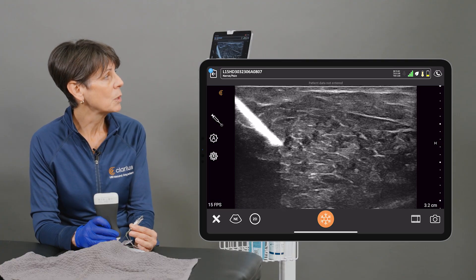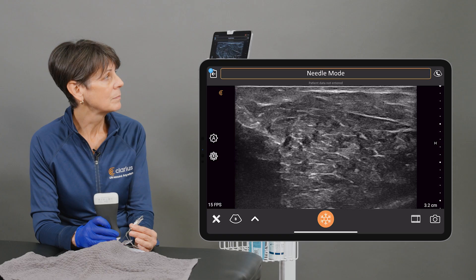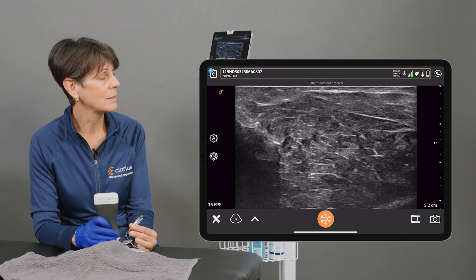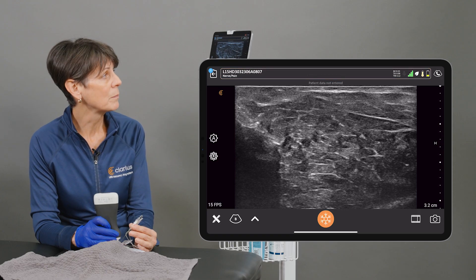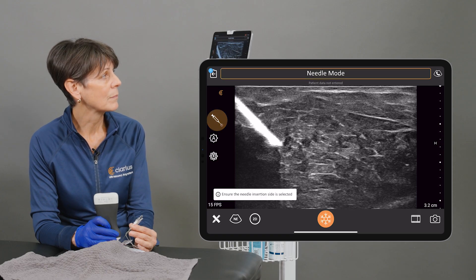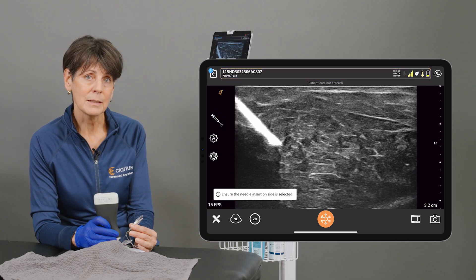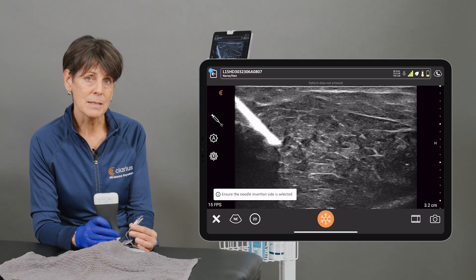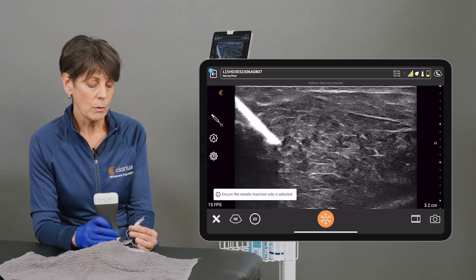Needle Mode — so you can see the difference that the Needle Enhance makes.